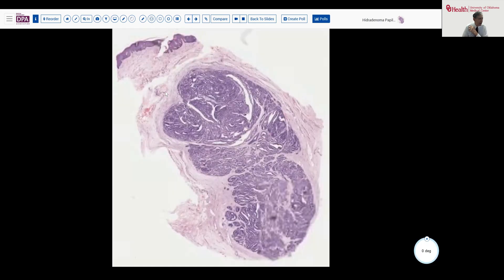This lesion was excised fairly simply. As you can see, it's sharply circumscribed. We have the cutaneous or mucosal surface up here. And as we look at this at low power, you're probably already recognizing what this is — a lot of slit-like spaces, sort of angulated structures in an overall lobular pattern.